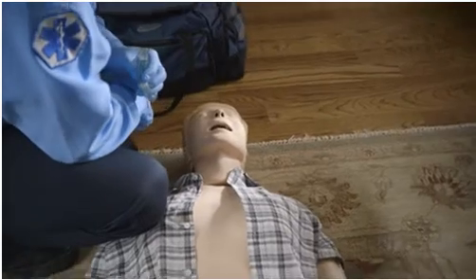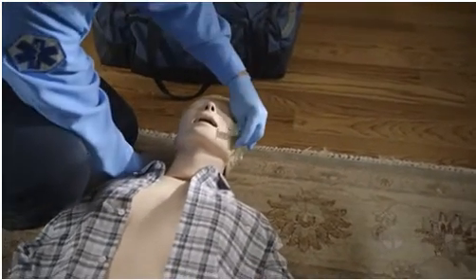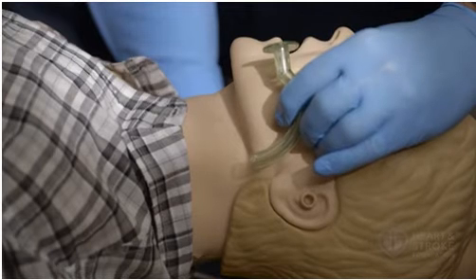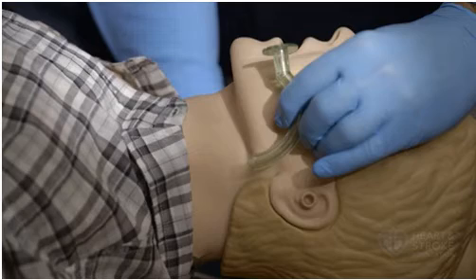Here's how to choose the correct size OPA. Place the OPA against the patient's cheek. When the flange of the OPA is at the corner of the mouth, the tip is at the angle of the mandible. A properly sized and inserted OPA results in proper alignment with the glottic opening.